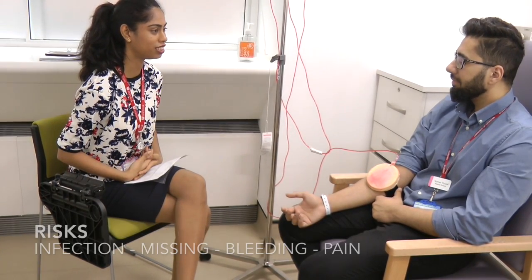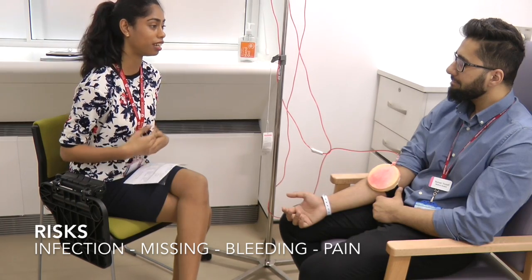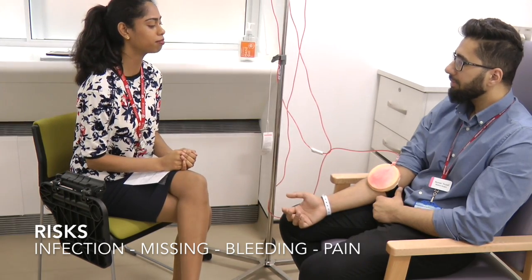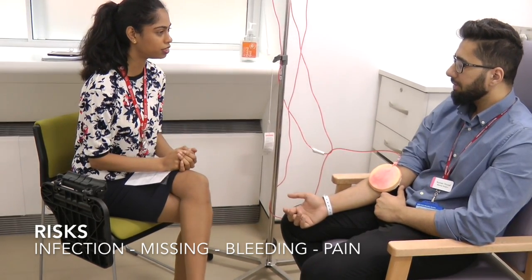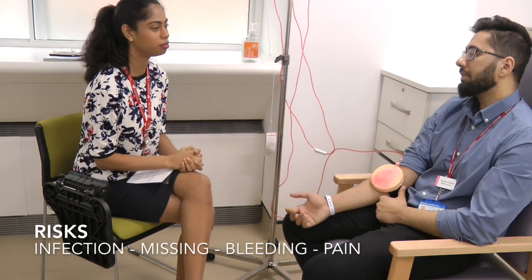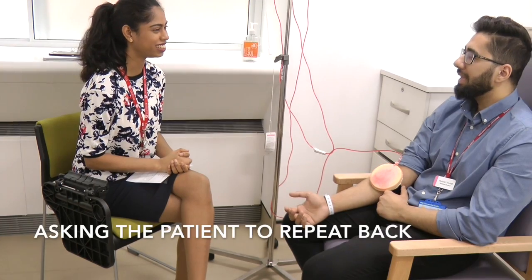There are some risks involved with the procedure. There's a risk of infection, but I'll be using clean equipment and a clean technique. There's also a risk that I may miss, and if I do, I'll try one more time or get someone else to have a go. There is a risk of bleeding, but I'll minimise this by applying pressure afterwards, which should minimise any bruising as well. And there is also a risk of pain — you should feel a sharp scratch as the needle goes in, but it shouldn't be anything excessive. If it does hurt a lot, please do let me know. Does that sound alright? That sounds fine.